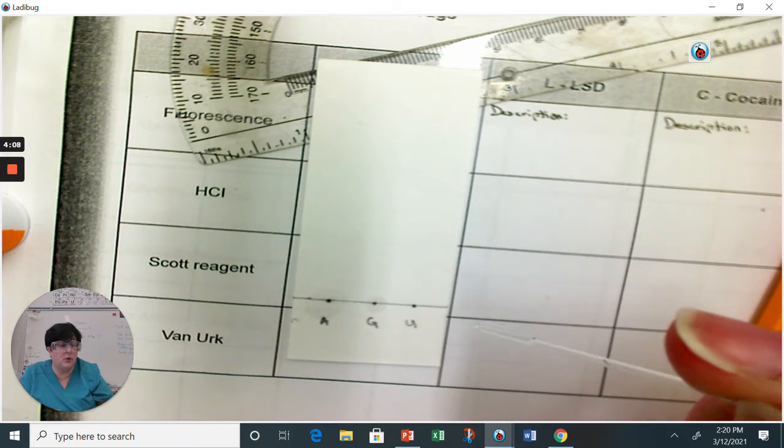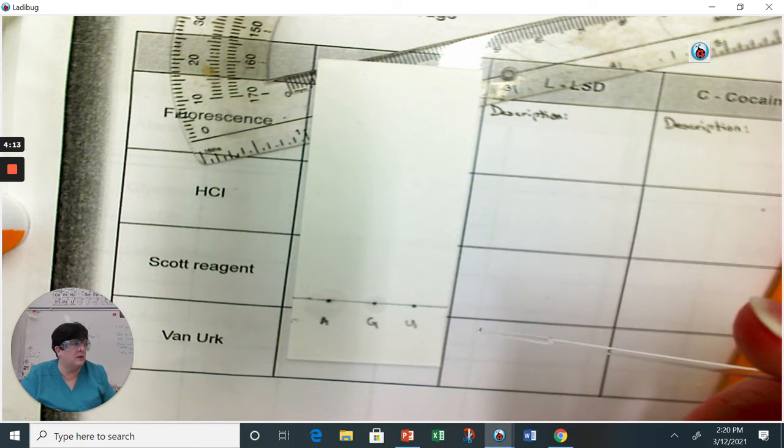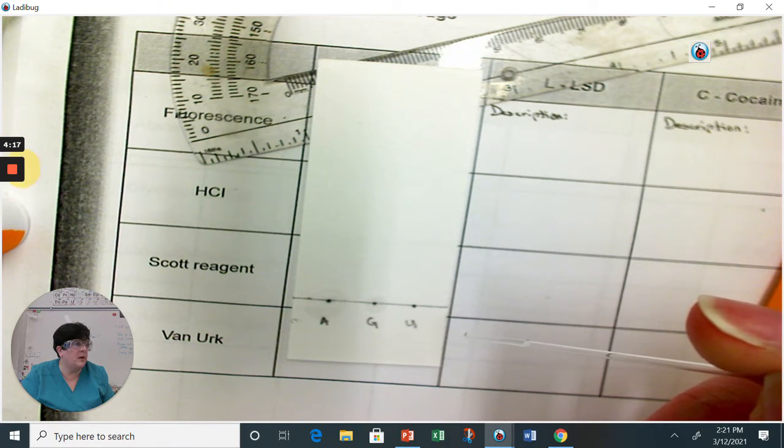Okay. I'm going to pause the video for a second because I have to get these dabbed on here. When I'm all set up, I will bring it back.